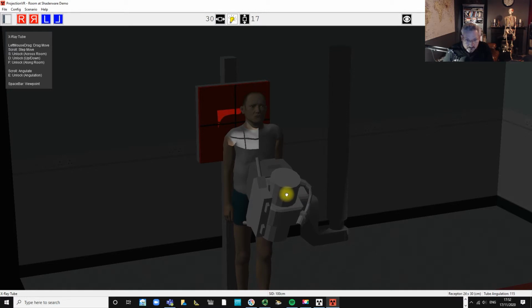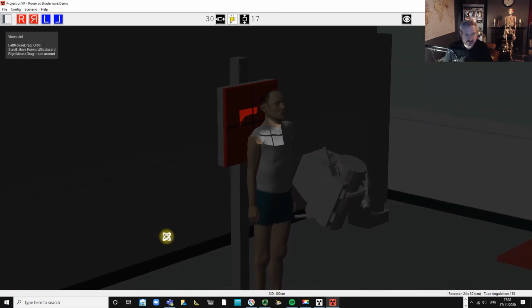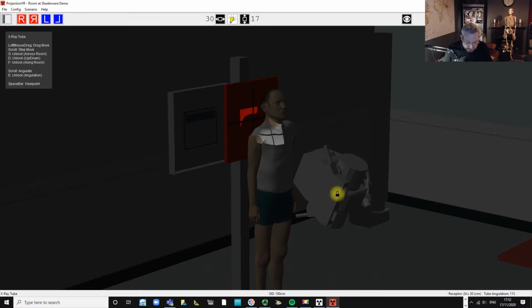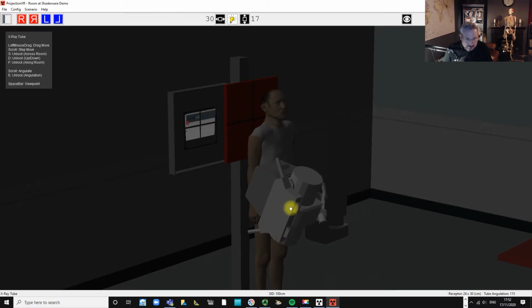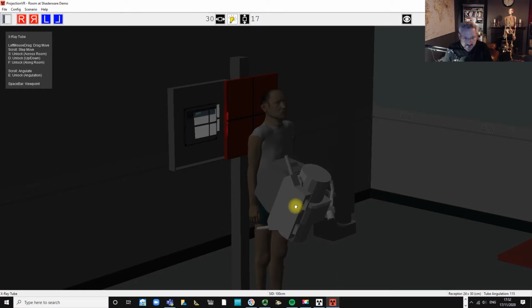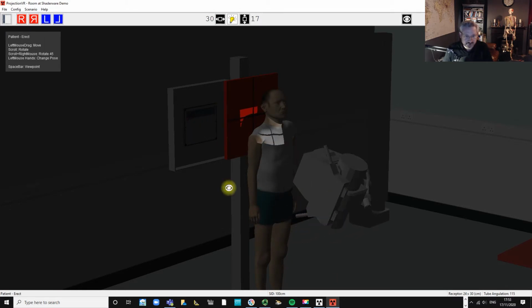Raise it up. So again, we're trying to go mid-clavicular line and include the medial aspect. And this time I think there will be some discontinuity. Yeah, so now we're centering. We need to raise the bucky up higher than it appeared we needed to.